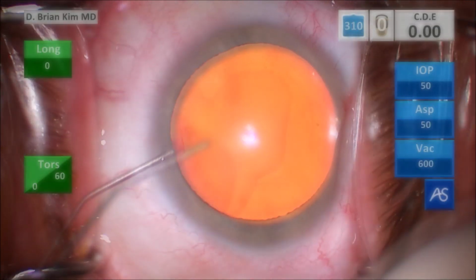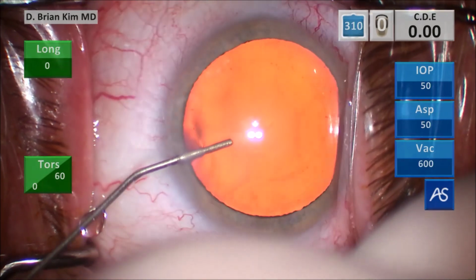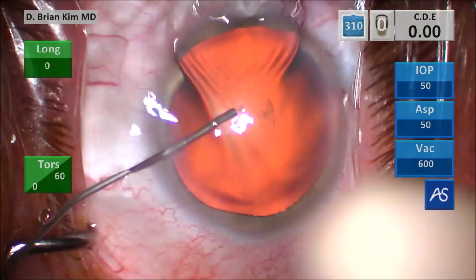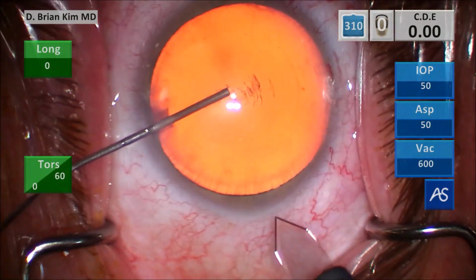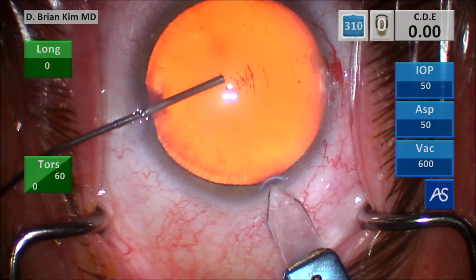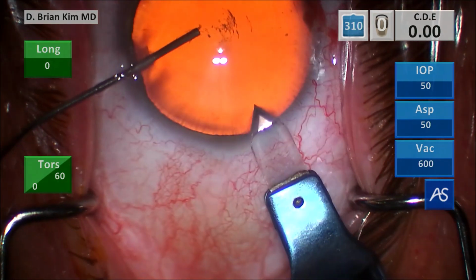This is intracameral lidocaine and some epinephrine and some dispersive viscoelastic to flatten the anterior capsule and coat the corneal endothelium. And this is the triplanar corneal incision. I make a vertical groove, place the blade into the deep part of the groove. You can see I have excellent control as I make my incision, and then I enter.